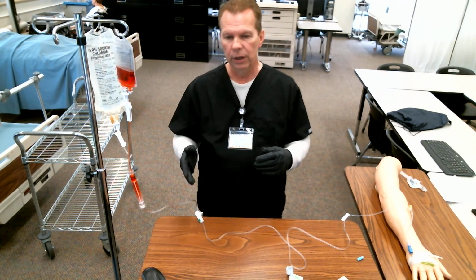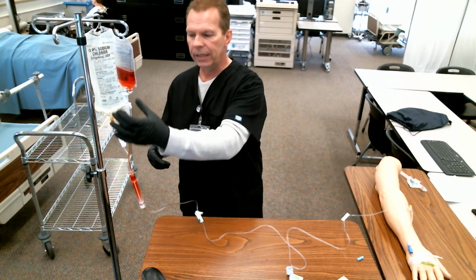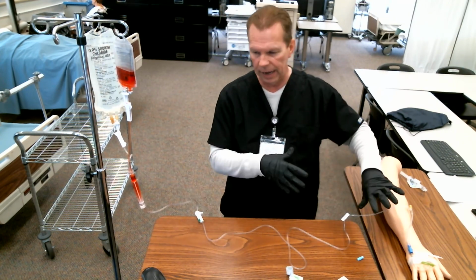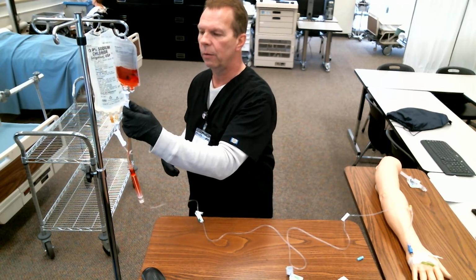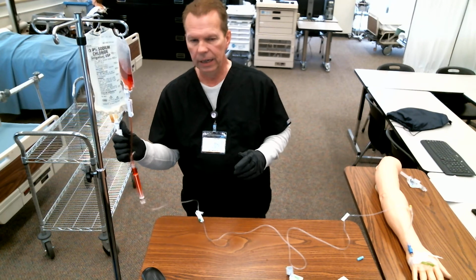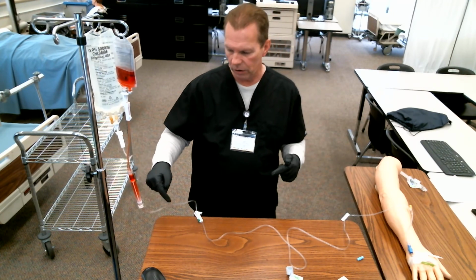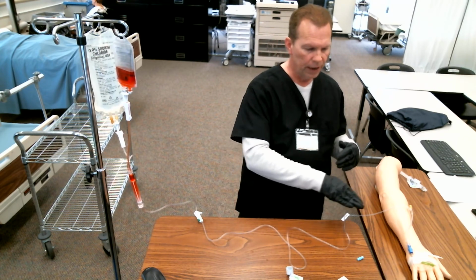Once the blood finishes running, here's what we're going to do. The bag is empty, but there'll probably still be some blood in the tubing down through here, all right? And I want the patient to get all the blood that they need. So I'm going to turn off the blood, and I'm going to open the saline and let the saline run at the same amount that the blood was running, because it's still just pushing the blood. So whatever I had my pump set on, I'm just going to let that go ahead and flush.